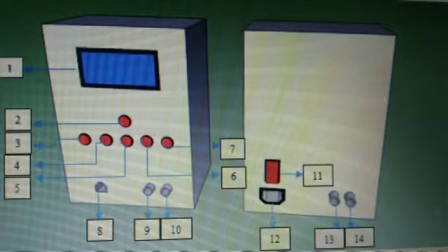The steps of this research are designing and processing, preparing material and equipment, observing, assembly planning, and process. Designing and researching. The topic I will discuss is how accurate the infrared photodiode sensor is on the flow rate parameter of the Infusion device analyzer with 2 channels.